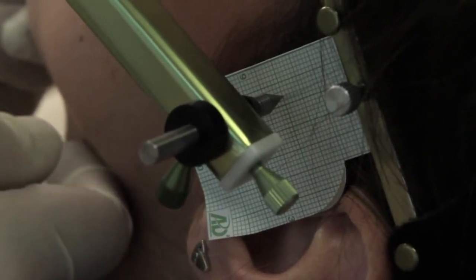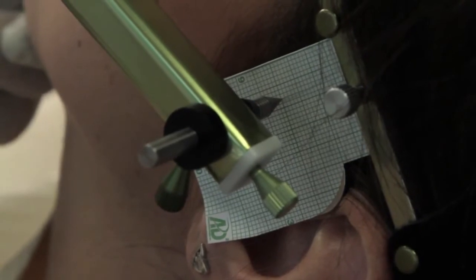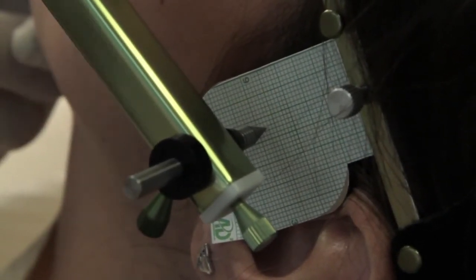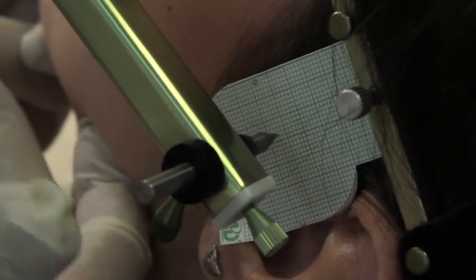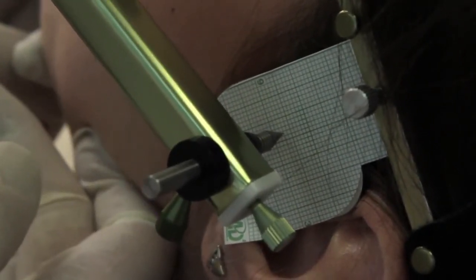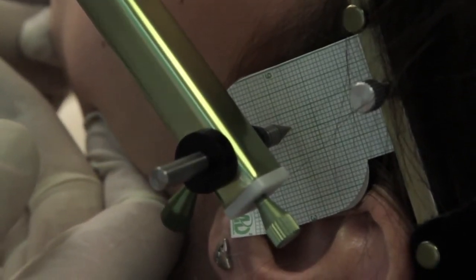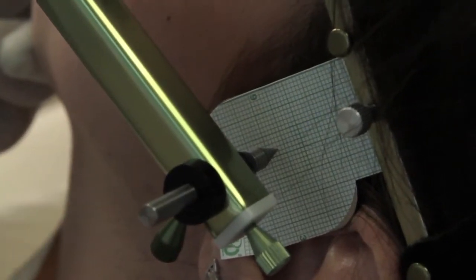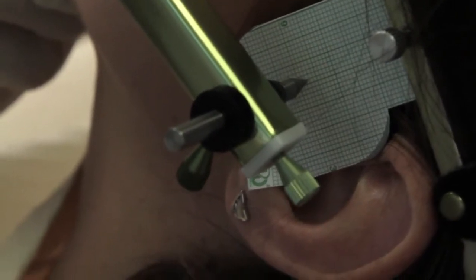Now then, I'm above and in front of the hinge axis. So I have to bring it down and go slightly posteriorly. I use the lines on the graph paper and relate the point of the stylus to those. When you get very close, you have to use the lines on the graph paper and the point of the stylus in relationship to a line to really know where you are and where you want to move.